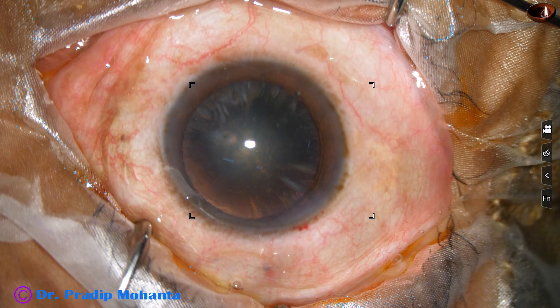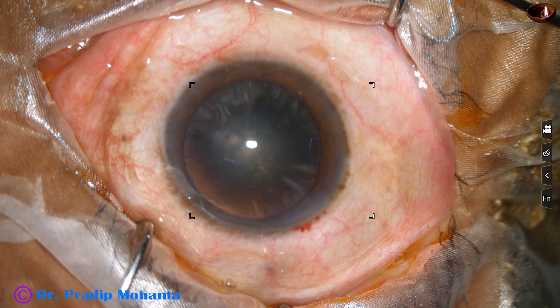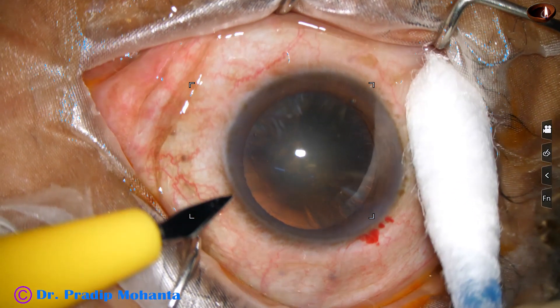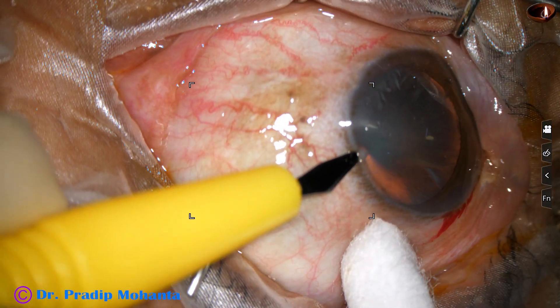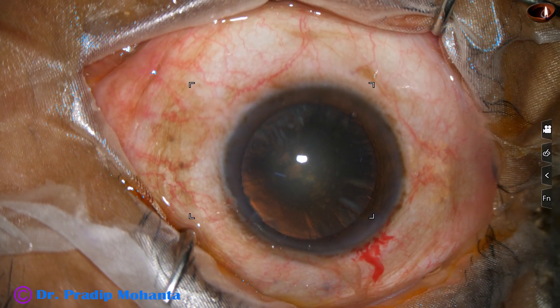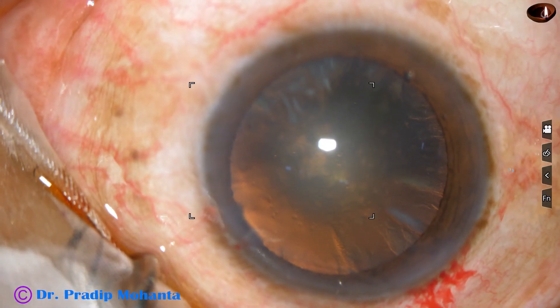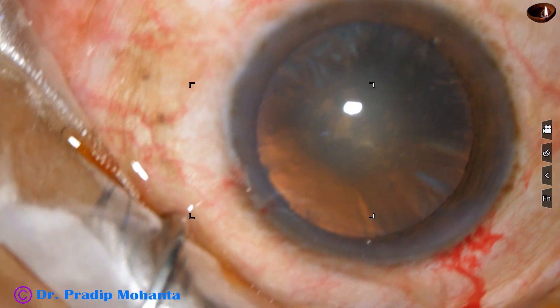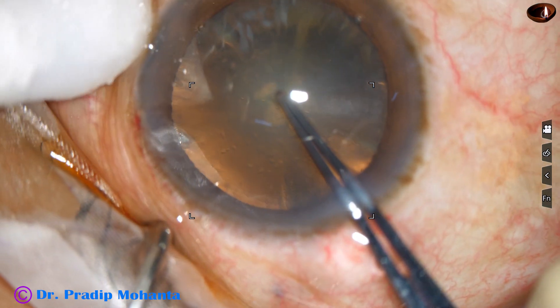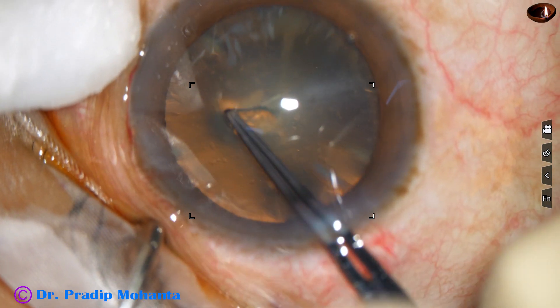This is a soft cataract. You can see this is a cataract with nuclear sclerosis of about grade 2. In such cases, it is very difficult to hold the nuclear mass, because as soon as you try to hold the nuclear mass with the faco needle using vacuum, you just eat up the lens matter in front.